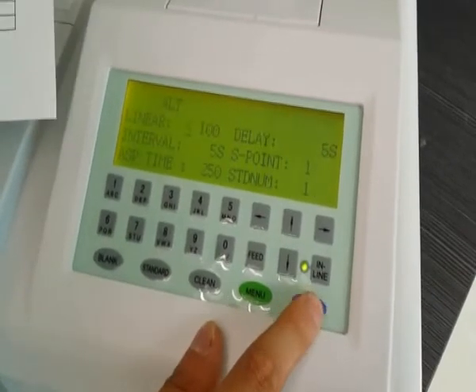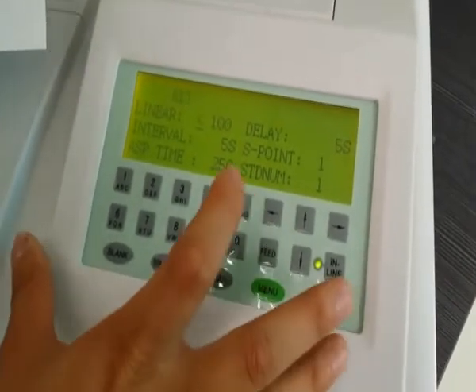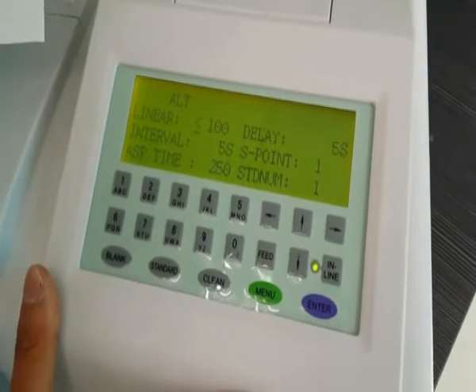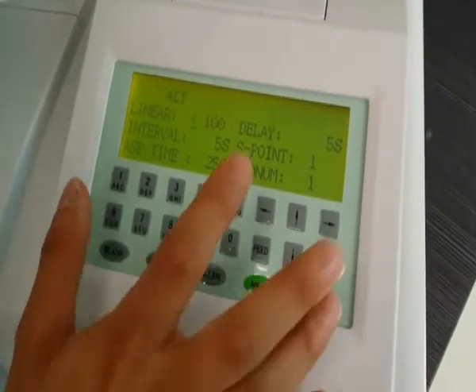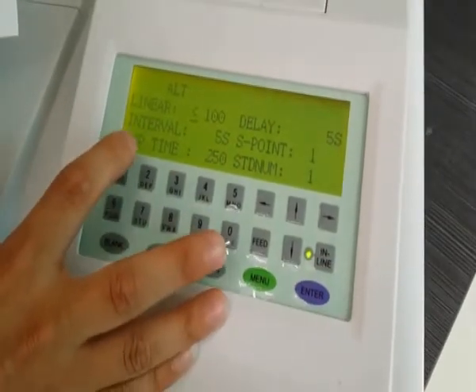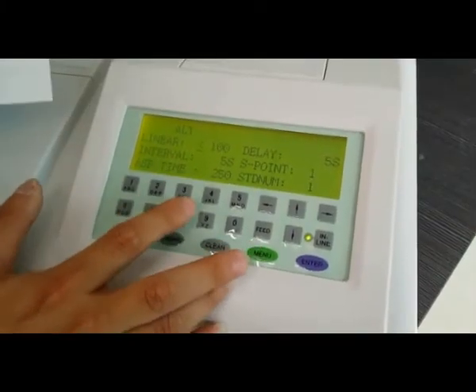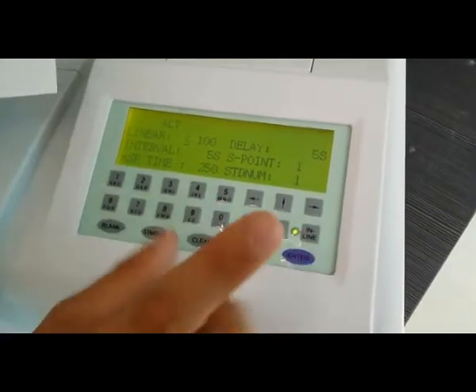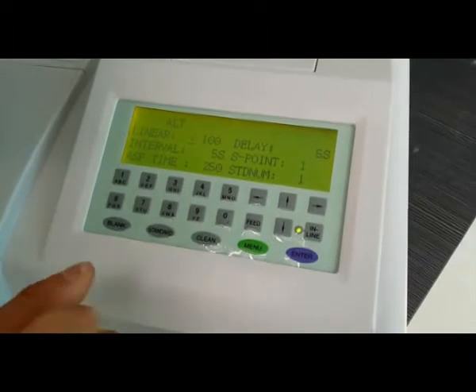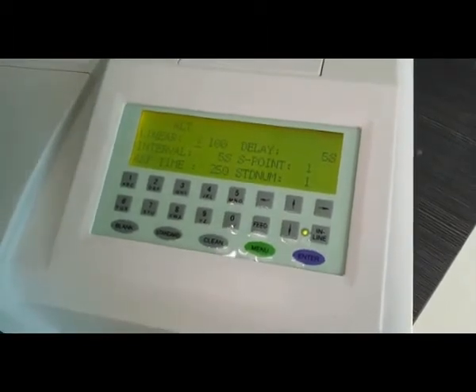you should strictly follow the reagent paper. Because this machine just can use the endpoint, so delay time and interval time is 5 seconds. And this S point, just should choose 1. Cannot change it.